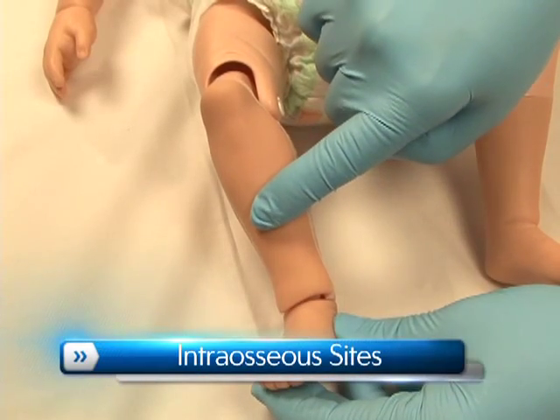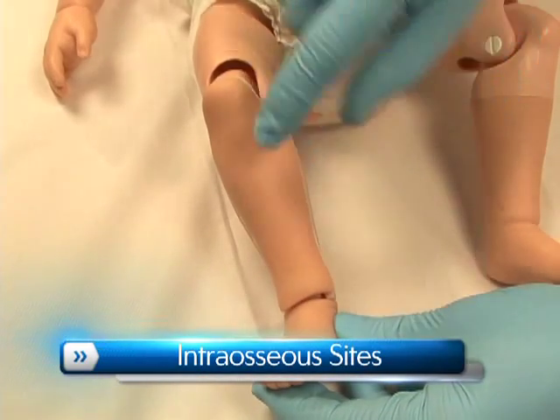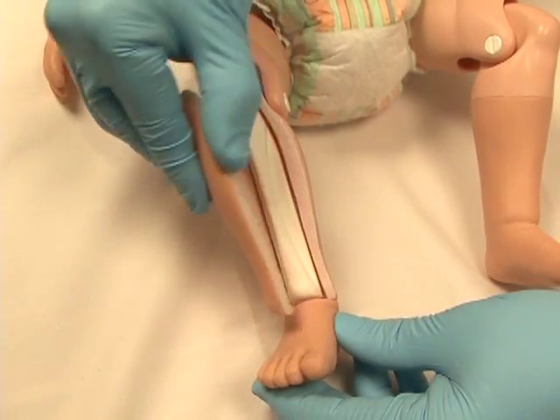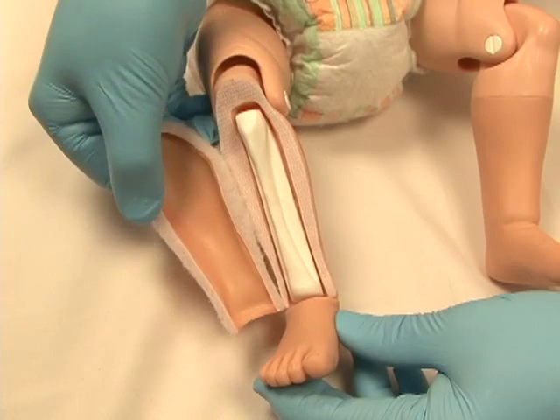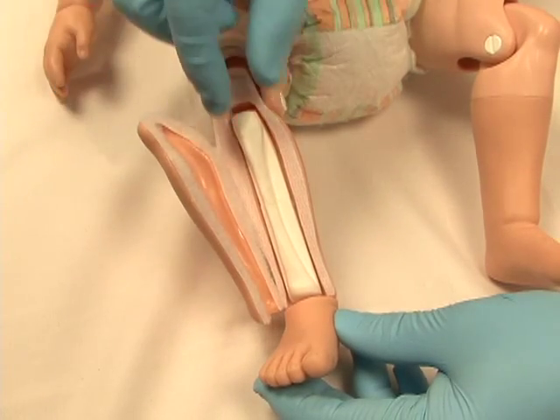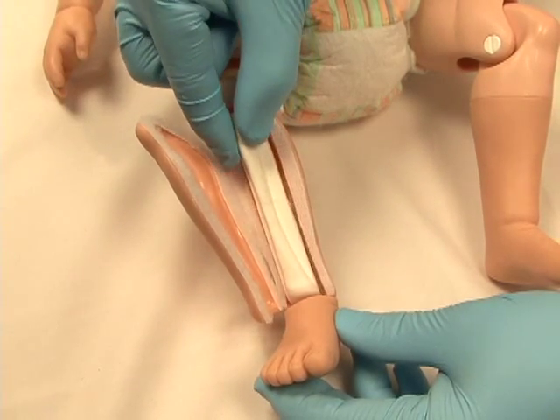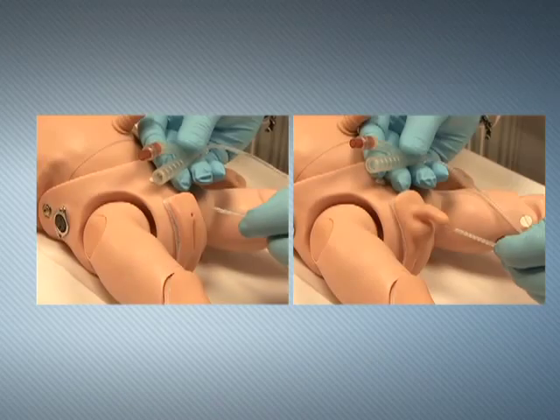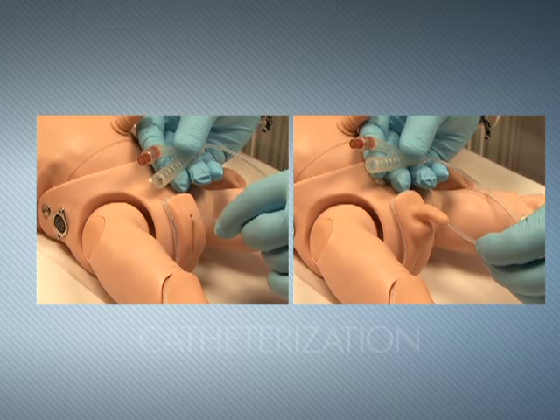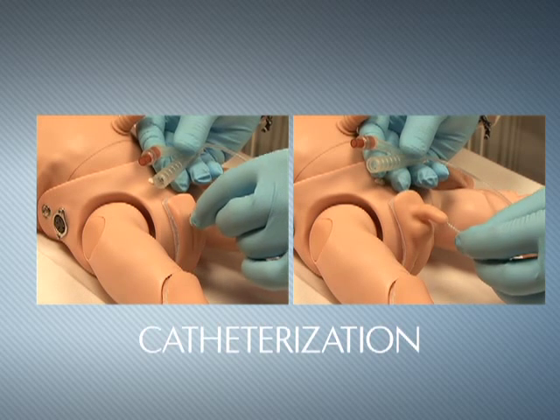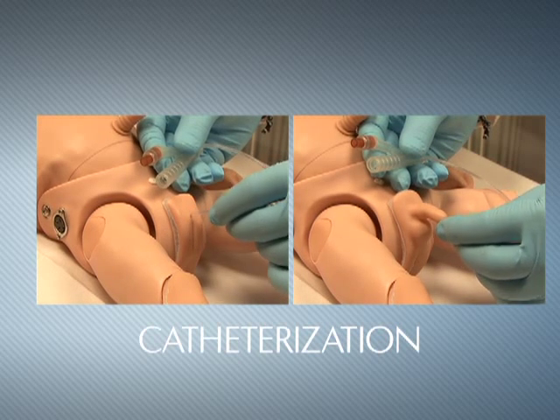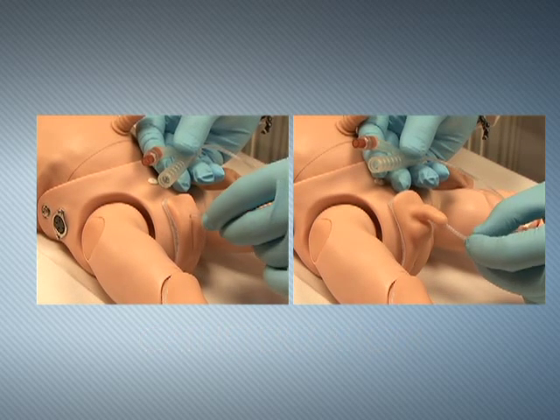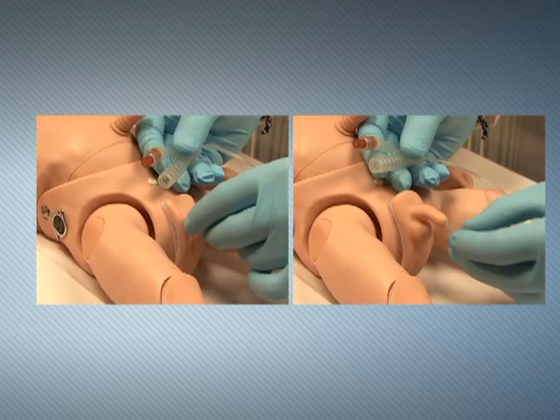The lower right leg has an intraosseous injection site with replaceable tibia bones. Newborn HAL can be catheterized via exchangeable male and female genitalia.